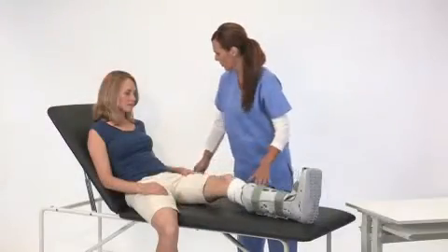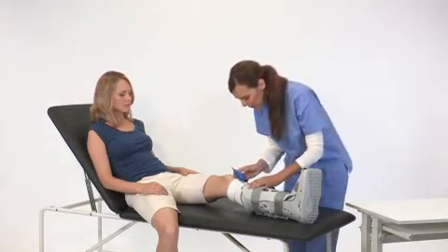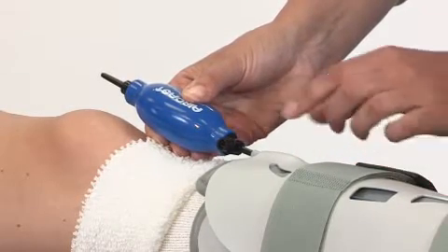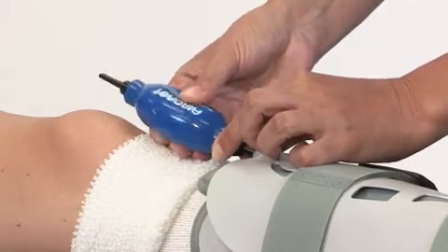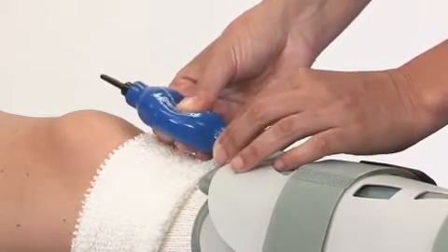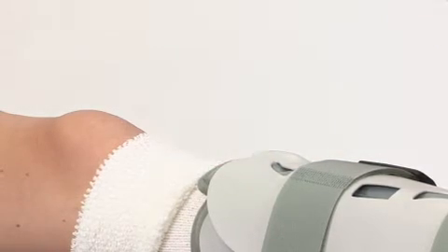Since the XP walking brace air cells are initially deflated, you'll need to inflate them. Begin with the valve on the front panel. Firmly insert the inflate tip of the hand bulb into the valve. Cover the hand bulb pressure relief valve with the finger of your other hand. Squeeze the hand bulb several times until the air cell is snug. Keep the hand bulb in the brace valve as you lift your finger from the pressure relief valve for three to five seconds, then withdraw the hand bulb.